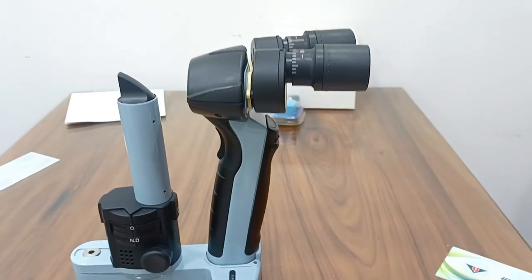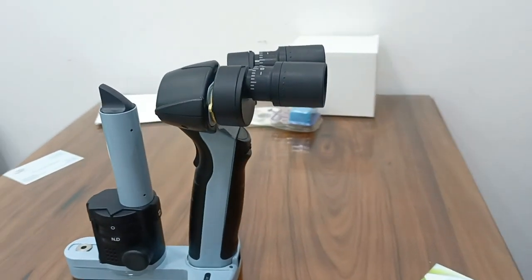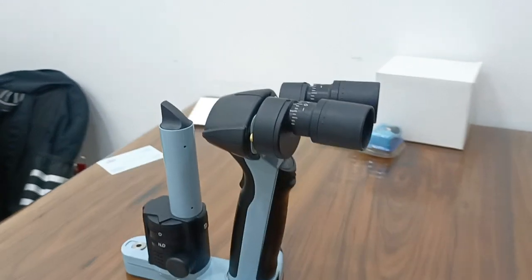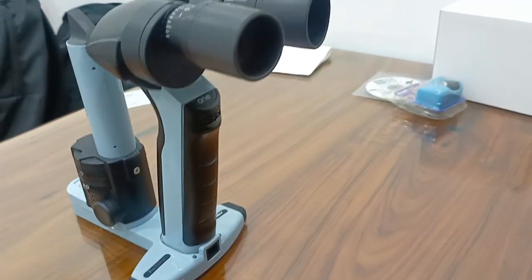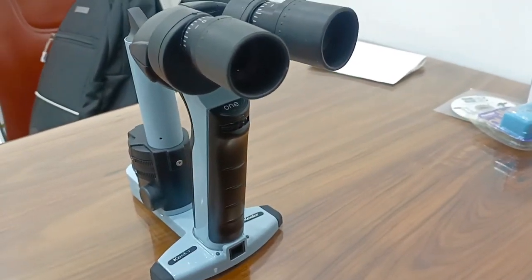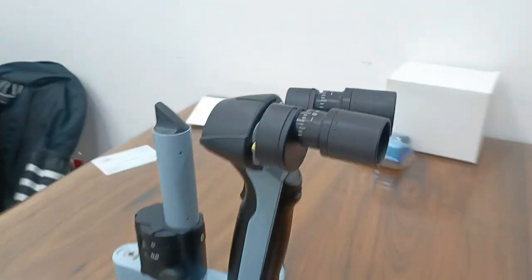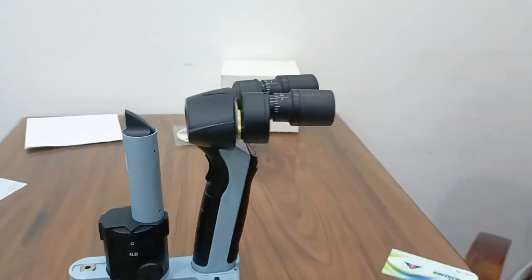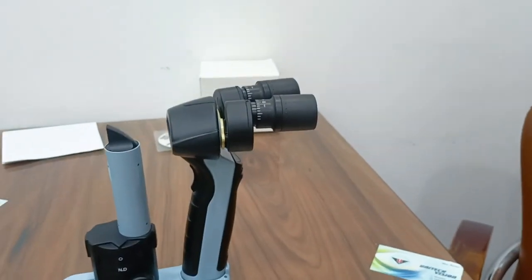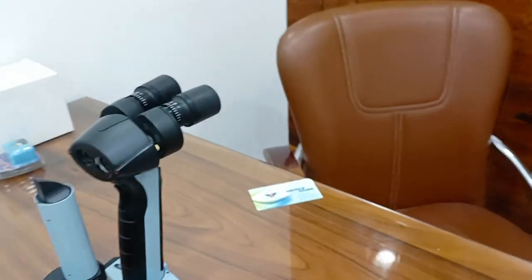Portable slit lamp made by Keeler UK with 10x magnification, fixed objective lens, working distance 100mm, and field of view 16mm.